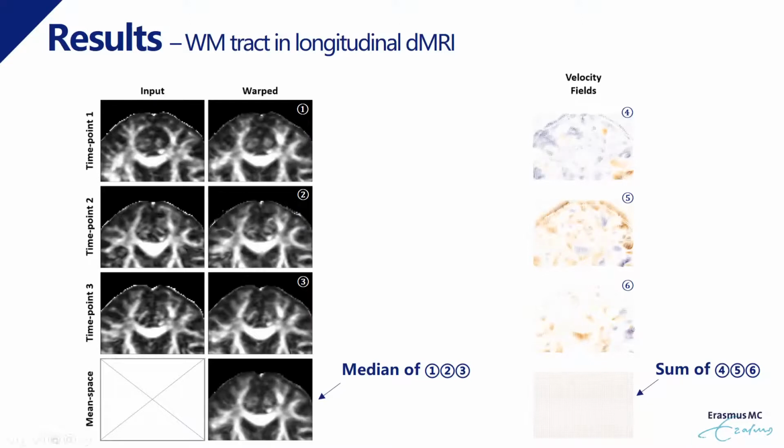This figure shows an example in analyzing 3 time points. We illustrate the geometric centrality of the implicit reference image by visualizing it and visualizing the estimated velocity field. In the second column, visual inspection of the warped images and their median image in the common space showed plausible average anatomy among the input images in the first column. The right column shows the estimated velocity field, mapping from image native space to the common space.